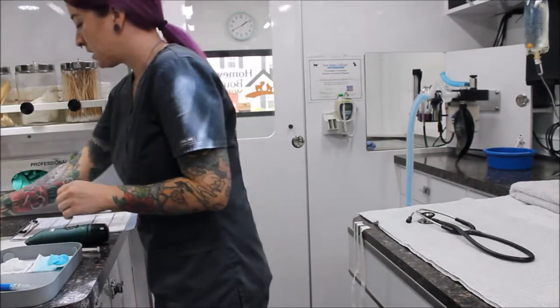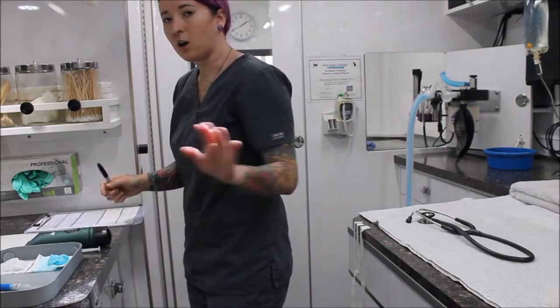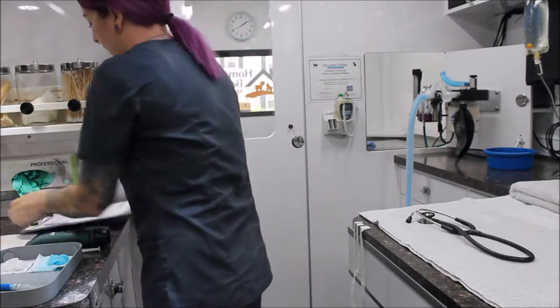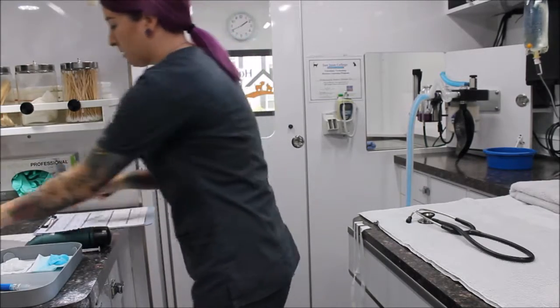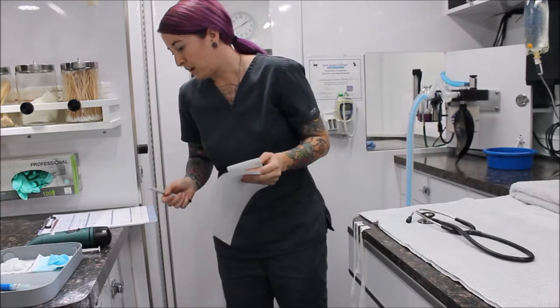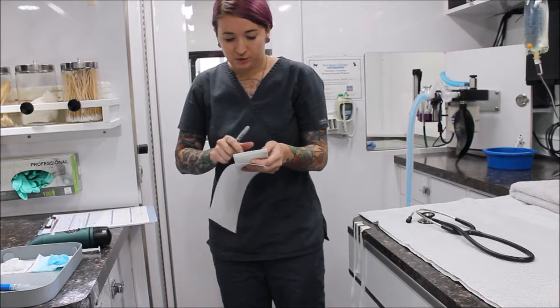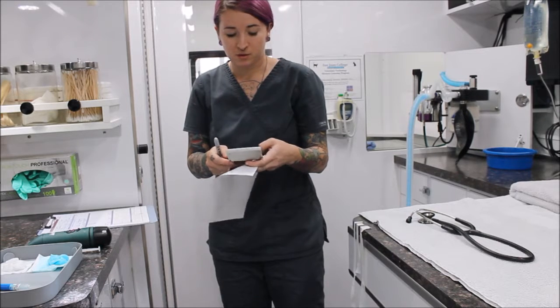And then the next thing that I'm going to get together is calculating the oxygen rate for my patient. So I have his anesthetic log here, and he is a 63.8 pound dog, so divided by 2.2, so he is 29 kilograms.